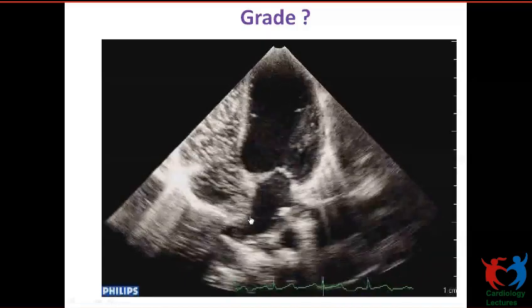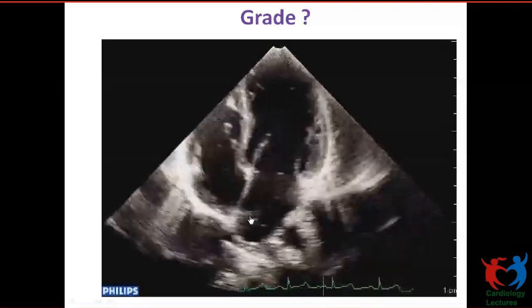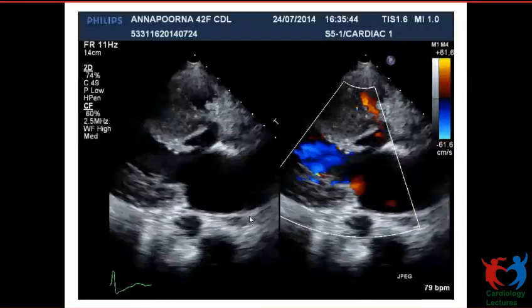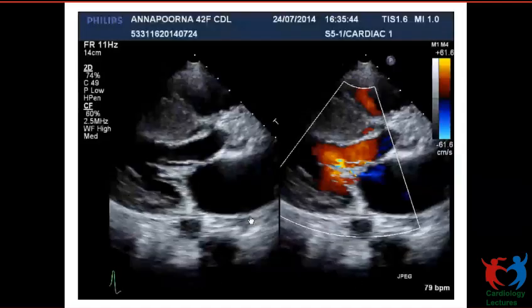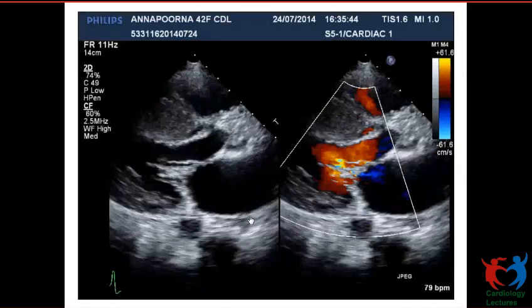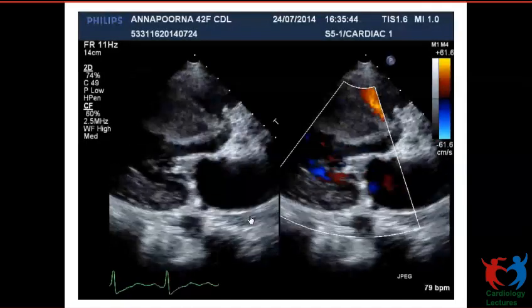Okay. Shall we go on? You all know how to do contrast echo, right? Today I think there is a talk on that, double contrast echo. Yes, ma'am. Correct. Any takers? This is very classical, every day you might be seeing it in the echo lab.